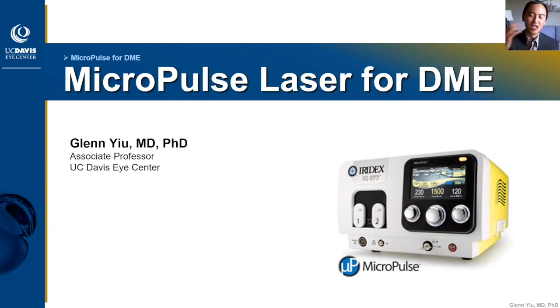Calzada and Dr. Horstman to see. And one of the things I find interesting is that everybody has very different methods of applying, because that was one of the questions in the chat: what exactly do you do for what treatment? And the fact that it works for all of us suggests that there is a little bit of variability in how we treat that can still all work. But one thing that all three of us are emphasizing is the density and the large amount of treatments. It's not just applying a few spots, it's applying broadly over a larger area and often involving the fovea.